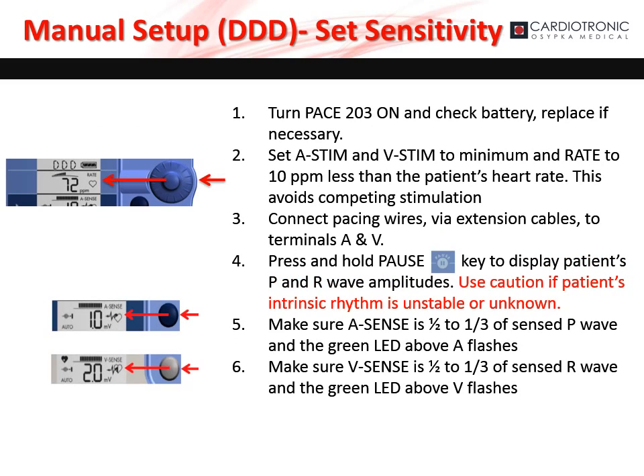To manually set up the PACE 203, first make sure that the device is on. Set A-STIM and V-STIM to the minimum value and set the rate to 10 beats per minute lower than the patient's heart rate to avoid competing stimulation. Connect the pacing wires via extension cables securely to the A and V terminals. Press and hold the pause button — the PACE 203 will display the patient's P and R wave amplitudes. Use caution if the patient's intrinsic rhythm is unstable or unknown. Make sure that A sense is one-half to one-third the P wave amplitude and the green LED above A is flashing. Next, make sure the V sense is one-half to one-third the R wave amplitude and the green LED above V is flashing.